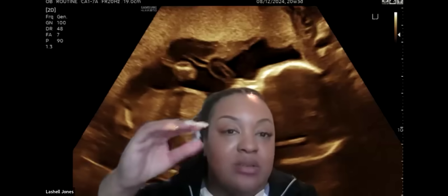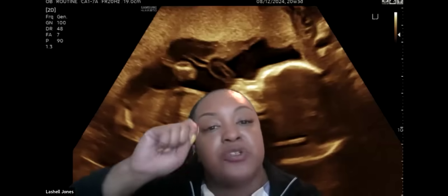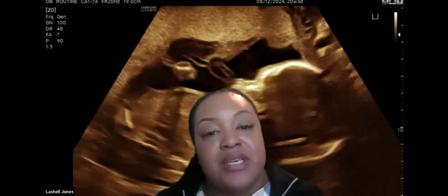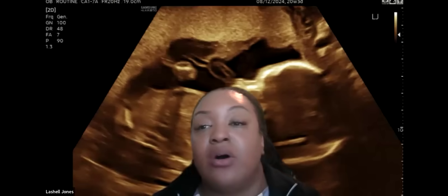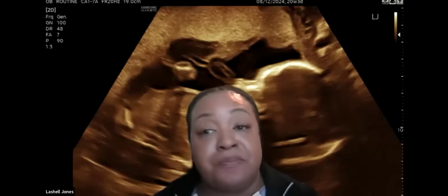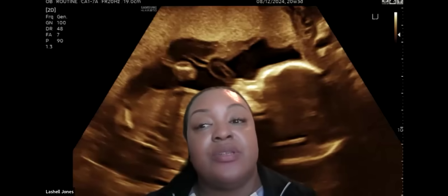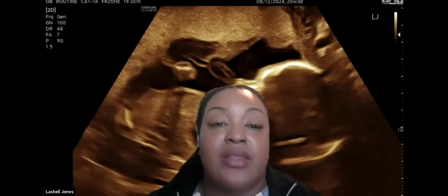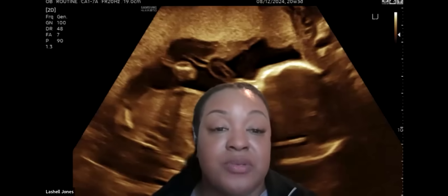What we have in place now are pretty much all the parameters, checklists for that fetus profile. And that's why that protocol is set in place. And I tell you, from that first trimester screening even to the level 2 ultrasound, that protocol has been so helpful in recognizing these markers.